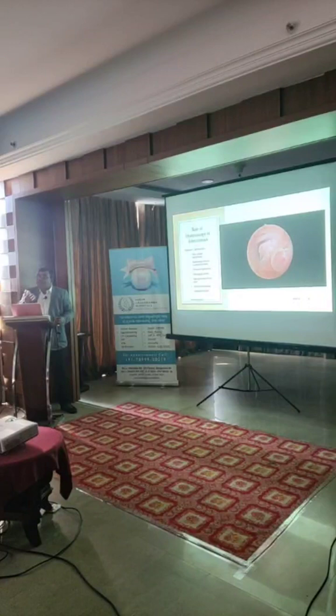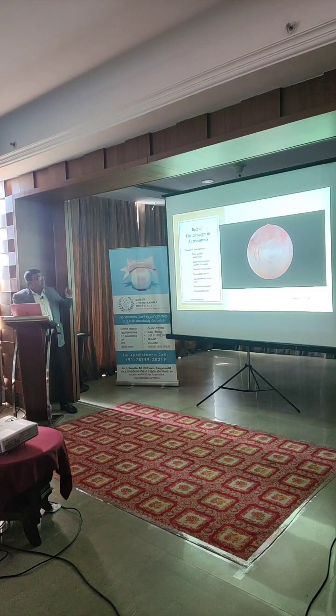So that is the first feature which tells there is an element of adenomyosis. And in this lady, she had a small polypoidal cervical polyp, and then you could see a lot of brownish fluid in the cervical canal, which tells that probably she has an element of adenomyosis.